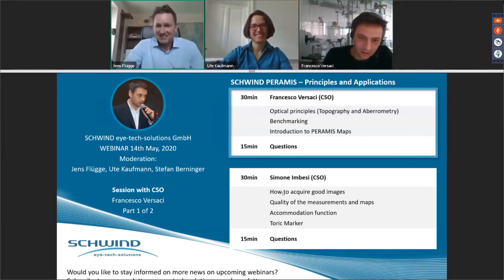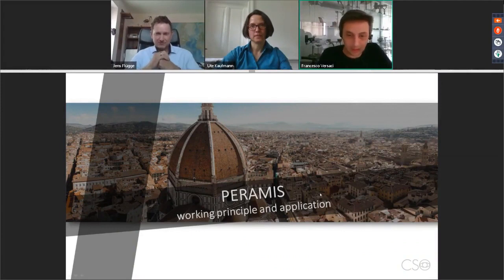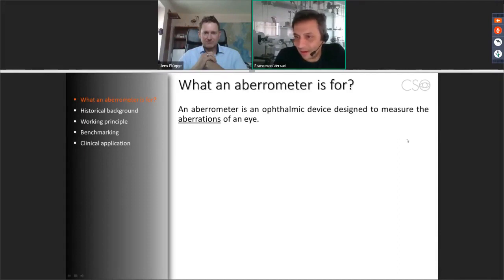Okay. I would like to thank the SCHWIND company for inviting me to this presentation. Today we are going to talk about the Peramis device, which is our Topography. It is a quite amazing and exciting device, but it's a bit complex.